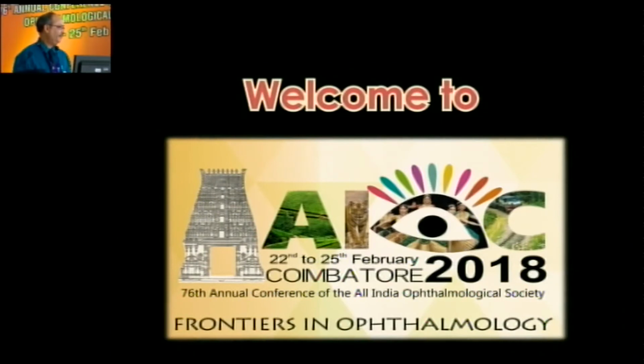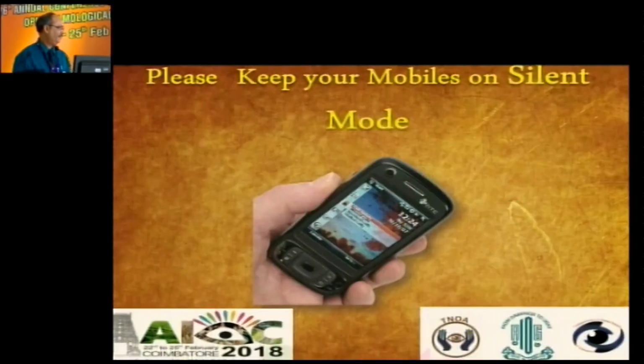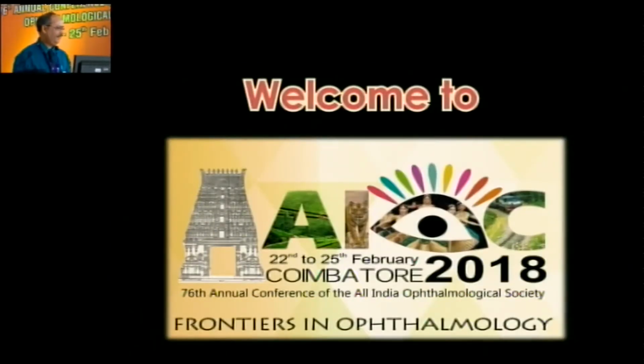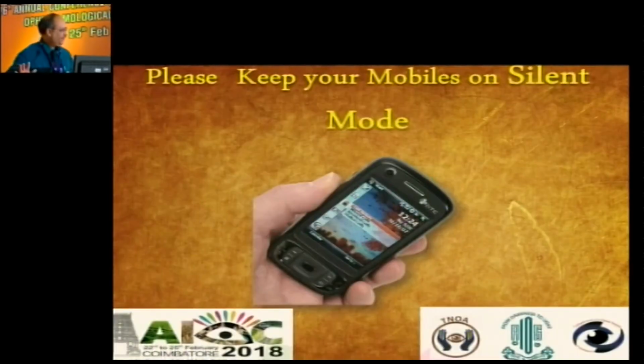Second problem you face, well, you try to put your phaco probe. The iris again comes on that side if there is a little tilting with this one. So if you want to handle that one, you can just make a small incision under this main incision, from where you can put an iris hook and take the iris back. So this iris will not obstruct in the port. That's again a very important trick. And just one comment I would like to say, that in my hands as of today, iris hooks work better than all other devices. And nice presentation, Dr. Malay.